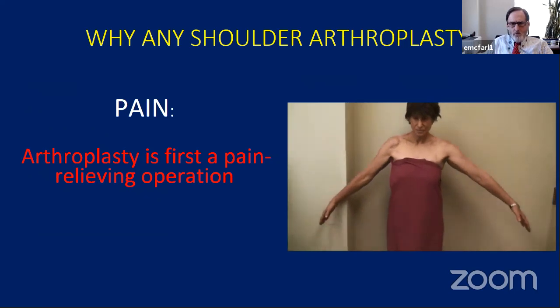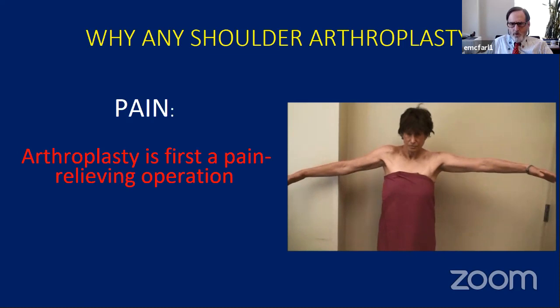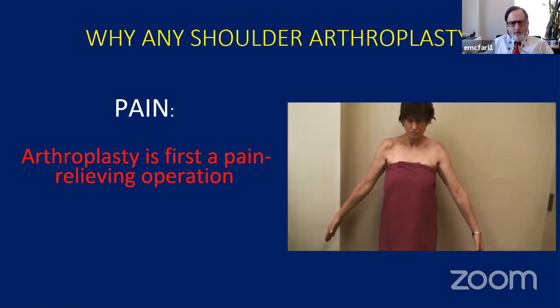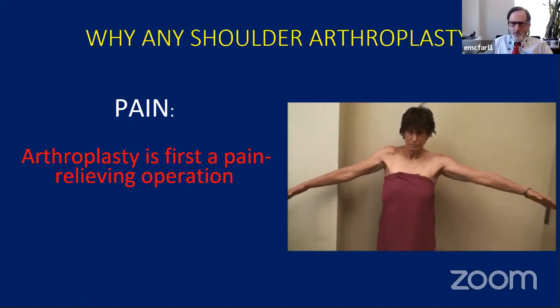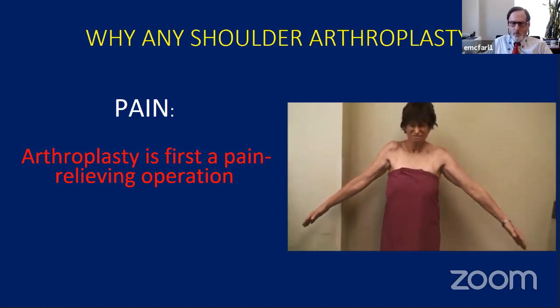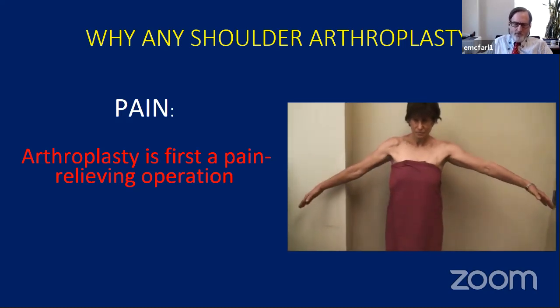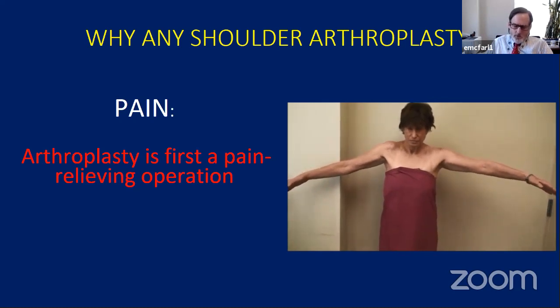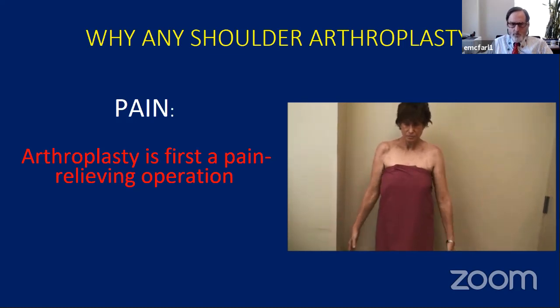So again, arthroplasty is first a pain relieving operation. And the reason that's important is that some of these patients that have cuff tear arthropathy, particularly, may not get massive improvement in their motion, but they'll at least have pain-free range of motion. So again, the main reason to do these operations is pain. Some patients have rotator cuff arthropathy and have no pain. And so operating on it for function alone, you're on a bit of a slippery slope, as we say.